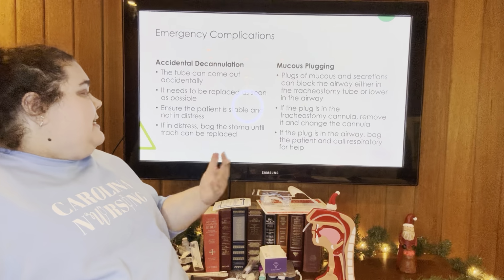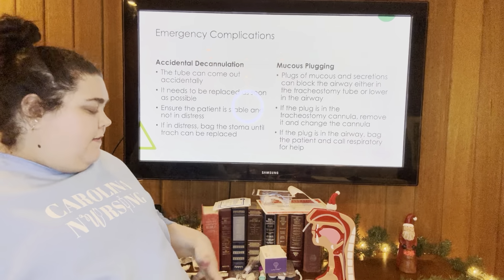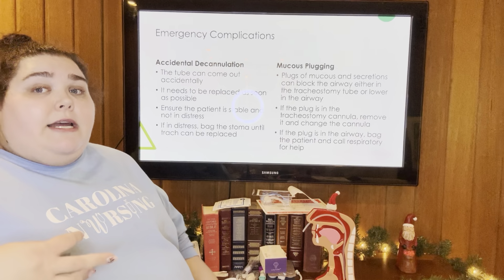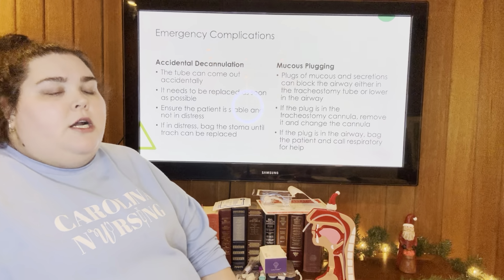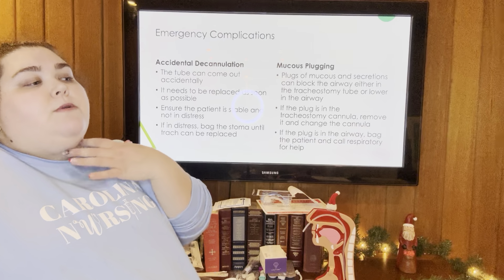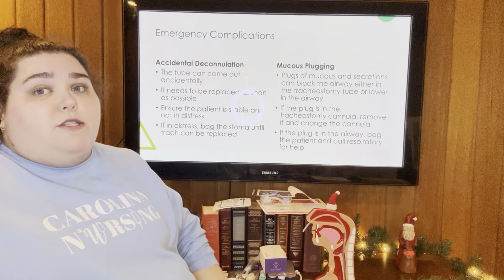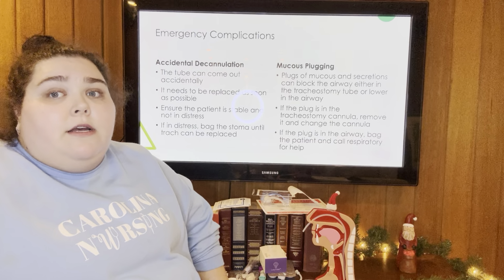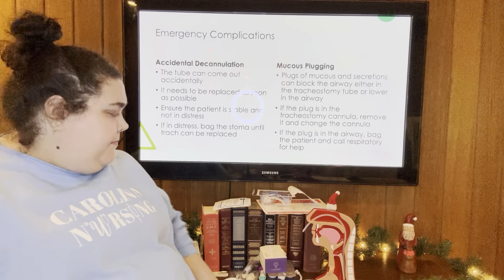If the patient is in acute distress, in the time it's taking you to get all of these supplies ready and get all the pieces together, then you can bag the stoma. So we'll talk about that again later when we're talking about bagging. But you can use the mouthpiece as if you were going over someone's mouth. You can just put that over the stoma, and it will kind of occlude the stoma and act as a little bit of a support until you can get the airway back in.